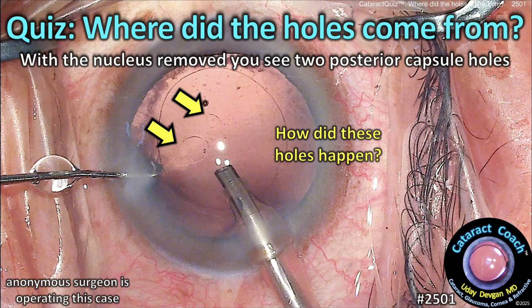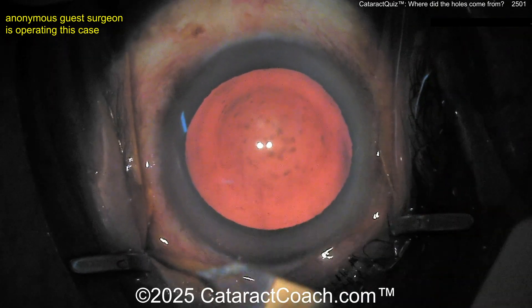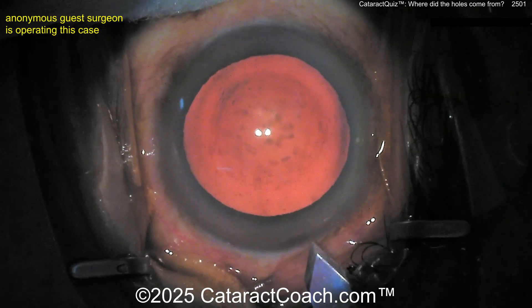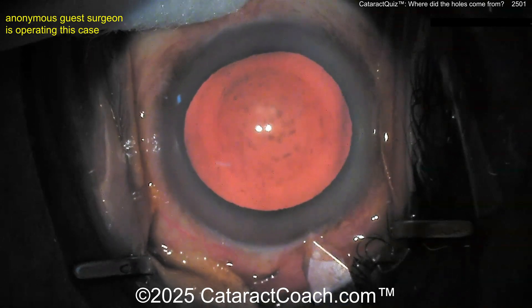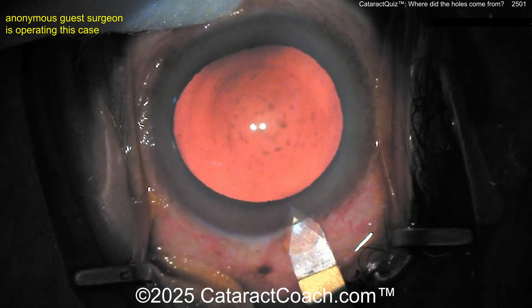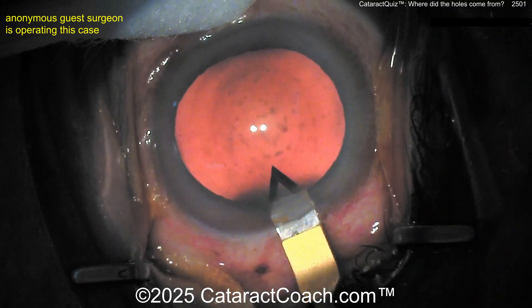This is a cataractcoach.com cataract quiz: where did the holes come from? The nucleus is removed, and then you see these two posterior capsule holes. Here at the beginning you can see the posterior capsule is definitely intact. There's no injection trauma, no posterior polar cataract — this is a routine cataract case. Look how nice that red reflex is. The mystery in this case is a tough one and I don't know the answer.